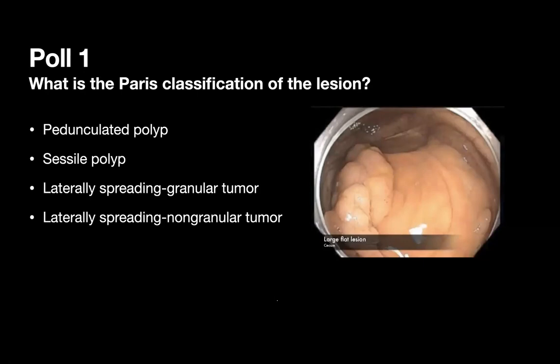Okay, all right. So Raju, may I have a comment? Yeah, please. I think that's a very good example. It is sometimes difficult to differentiate a laterally spreading tumor from a sessile polyp. What we could do in this case is insufflate air and desufflate to make a better judgment of the height of the lesion versus width, as Professor Sutikno explained.